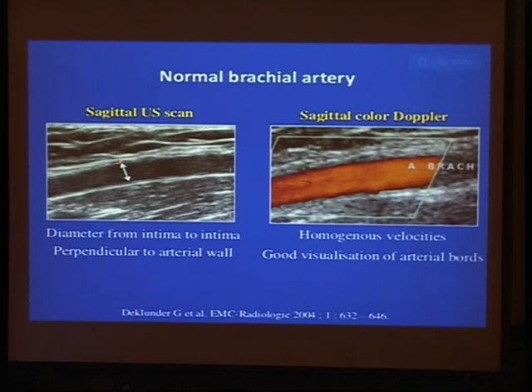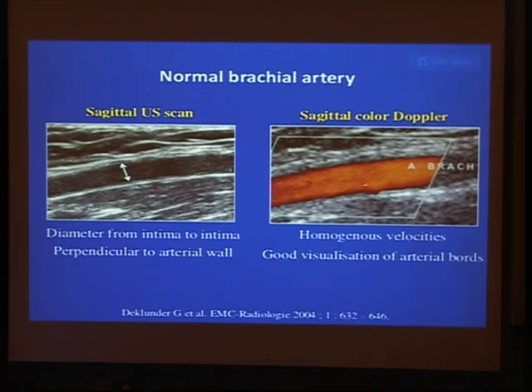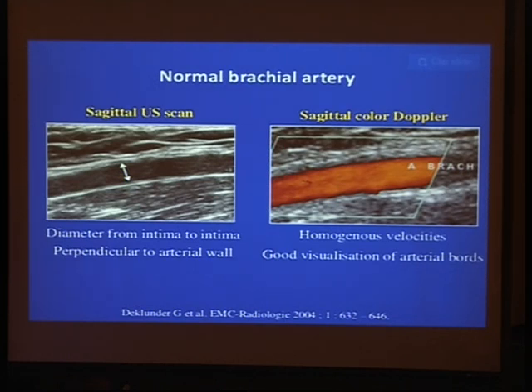This is an example of Doppler ultrasound for arterial evaluation — a normal radial artery. We have to measure the diameter from intima to intima. The artery must be not less than 2 mm from intima to intima. Color Doppler must show no luminal occlusion, no calcification, and normal flow.